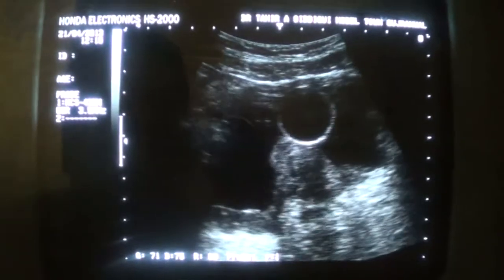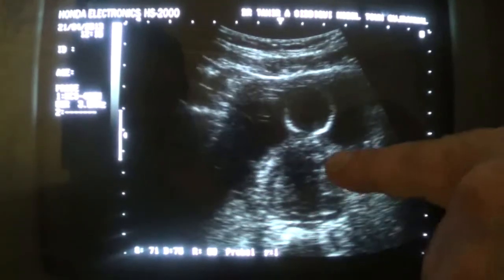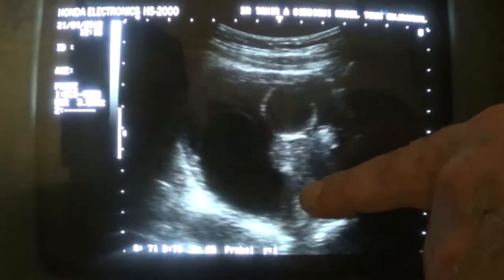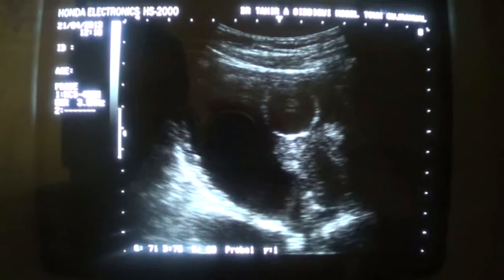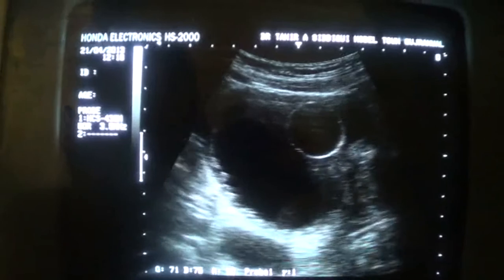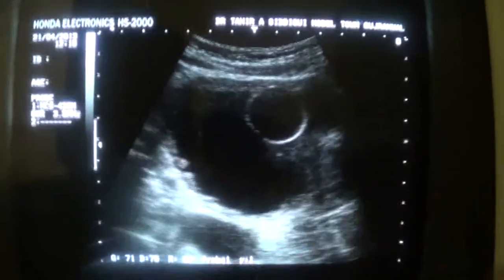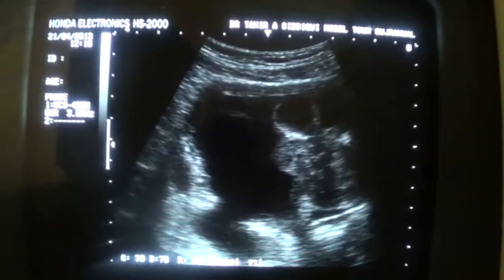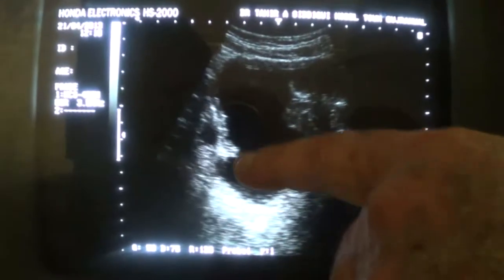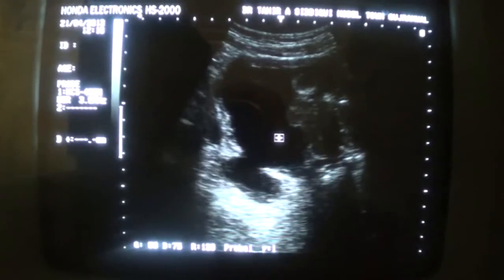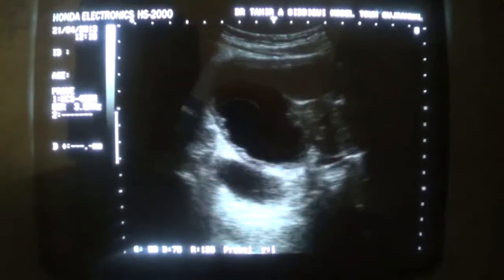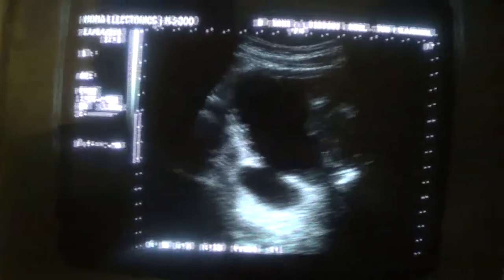This is the urinary bladder, this is the catheter, this is the prostate and the enlarged median lobe indenting into the urinary bladder. The bladder wall is showing hypertrophic trabeculations, and this is the diverticulum. So, this is the case of the day. Thank you very much.